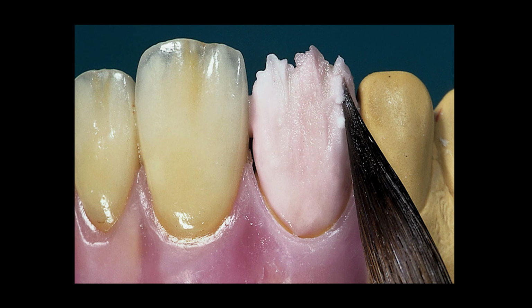Now here's another photo that'll kind of bring this home. We talked about different porcelains that we can use in the laboratory. Now this is a picture of us building a ceramic tooth. Now you notice on the tooth that we're working on, porcelain comes in different powders, and we can layer and stack different powders. Now look at the central to your left. See the effects that we were able to build in. See the different mamelon effects, the different translucencies, the different oranges. Now, is this reality? Are you going to see this in that effect in a natural tooth?